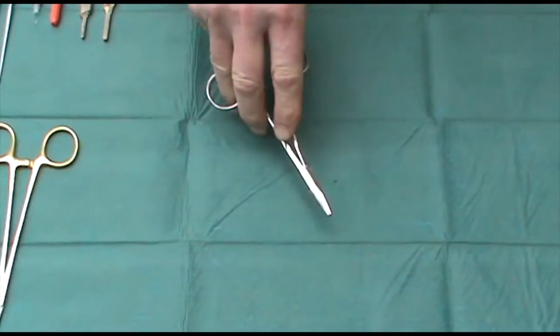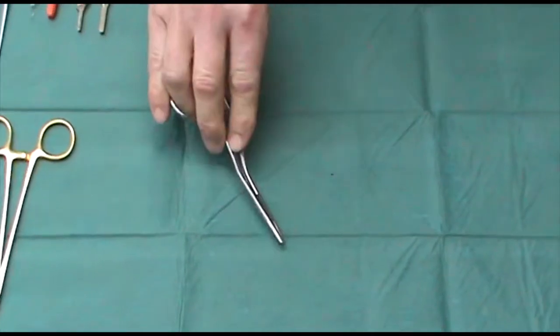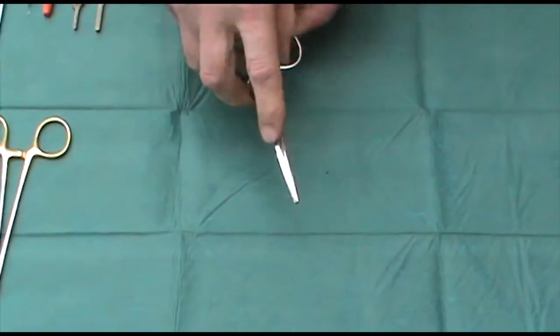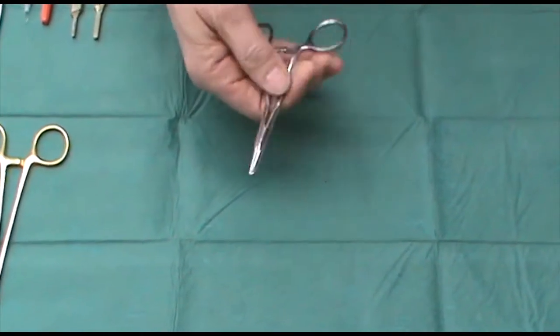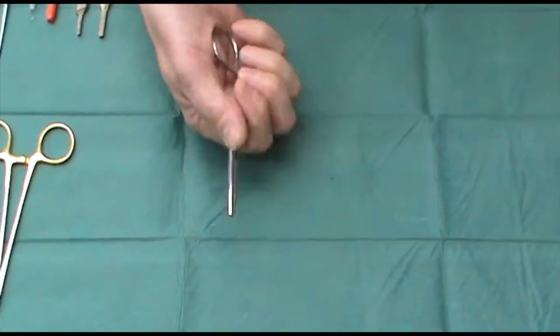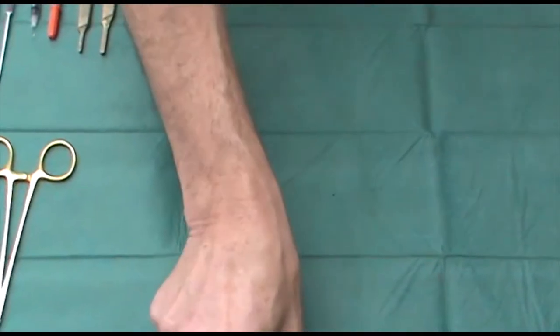The idea here is that you can hold the needle holder like this, and therefore get it close to the skin. However, I see lots of people trying to use them like this, which is difficult, and also they are virtually impossible to use in a palm grip. So I try and avoid those if at all possible.